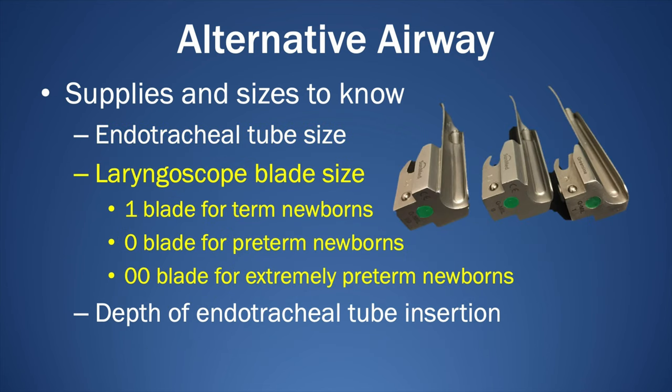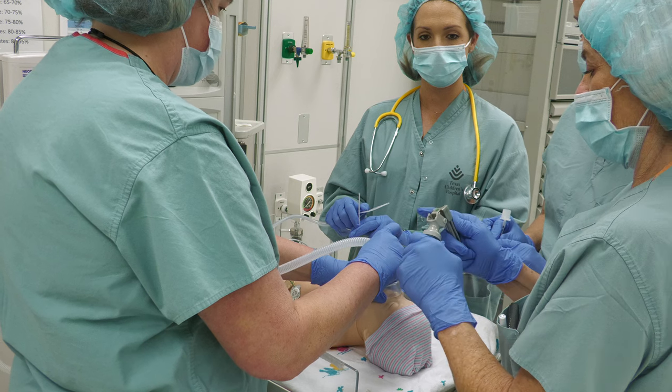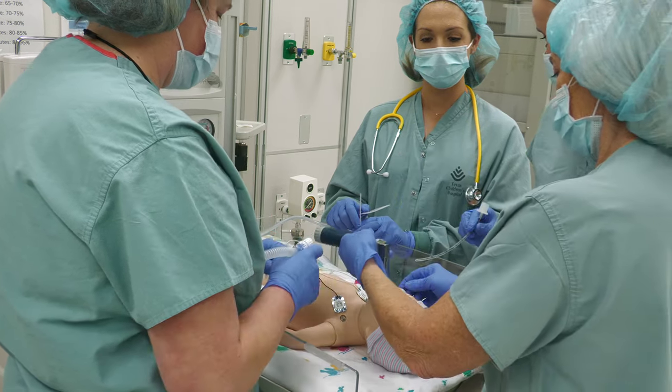Choice of laryngoscope blade size is chosen on size and gestational age of the baby. A 1-blade is for term, a 0-blade is for preterm, and a 00-blade used for the extremely preterm. Attach the blade by pulling it down toward the base of the handle. Be sure to check that the light is working before you use it.